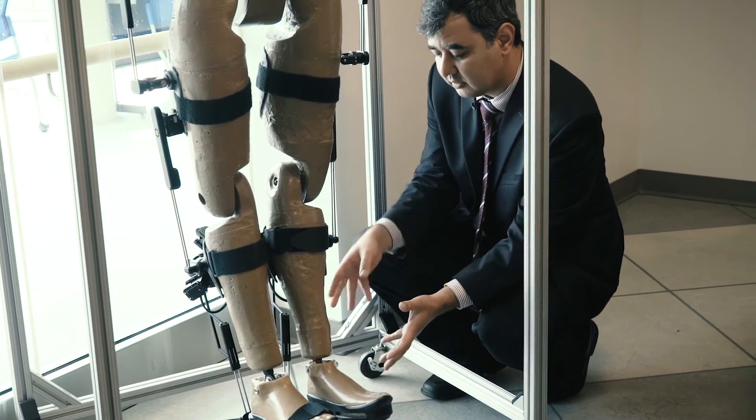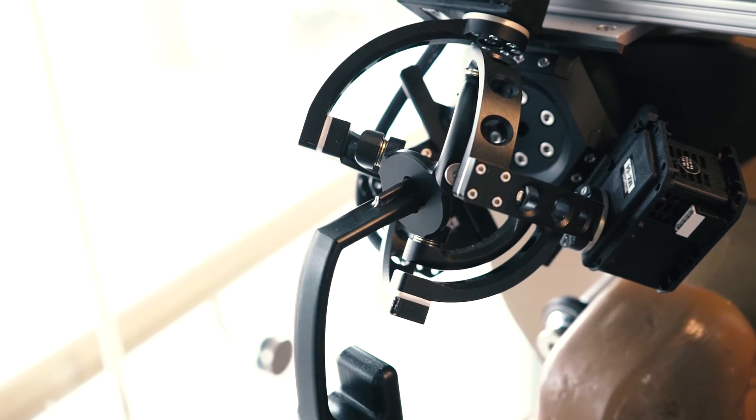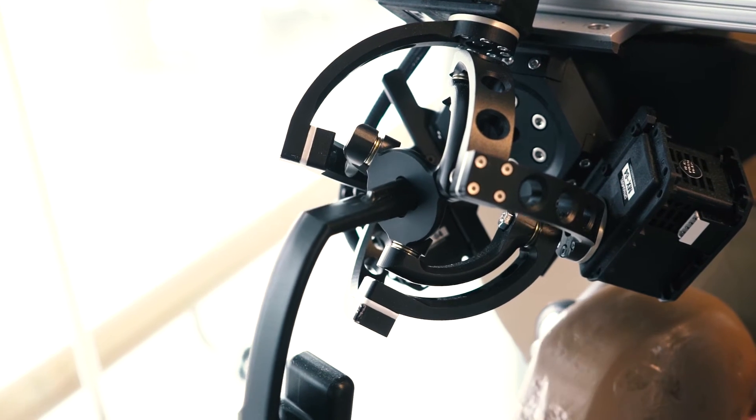Most of the exoskeletons you see in the market have limited range of motion for the person who wears it. For example, the hip joint, which is naturally a three degrees of freedom joint, is actuated by only one degree of freedom motor. So a joint that should have motion in all directions is restricted to move in only one direction.